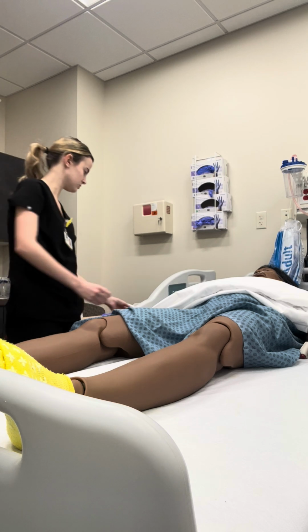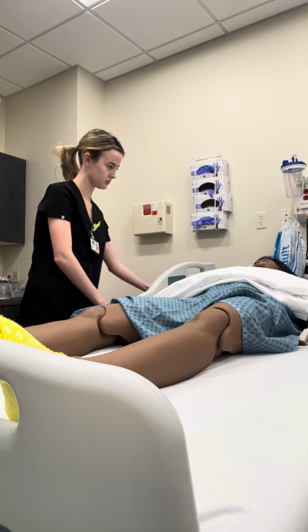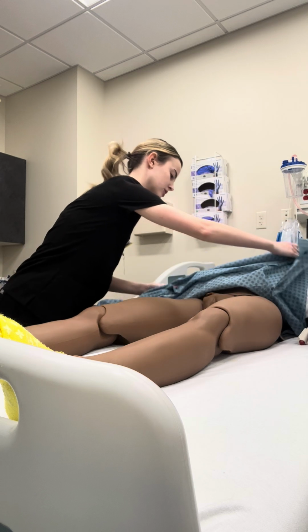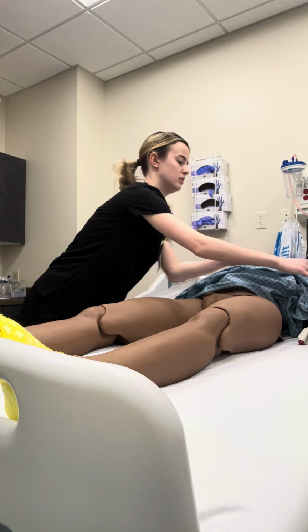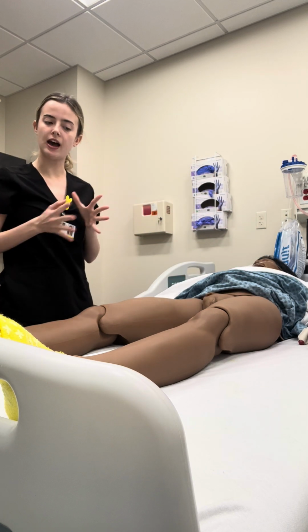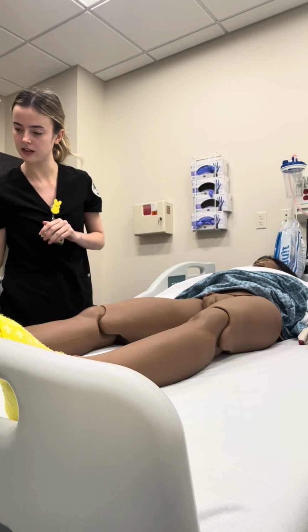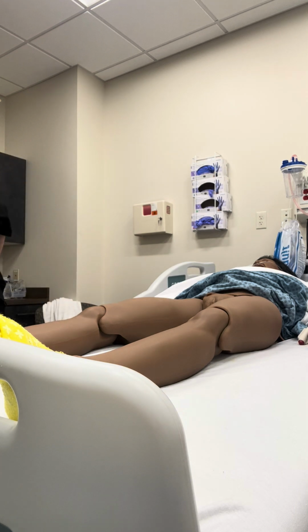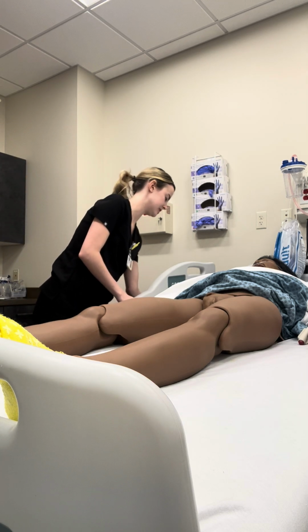Okay. And I'm just going to lift your gown and we're going to keep it right here on your abdomen as well. So I would provide pericare, so I've already done that. It's dried well. And now I'm going to go ahead and wash my hands and then we'll get started, okay? So now I go, wash my hands, come back, and then I'm going to lower the side rail.